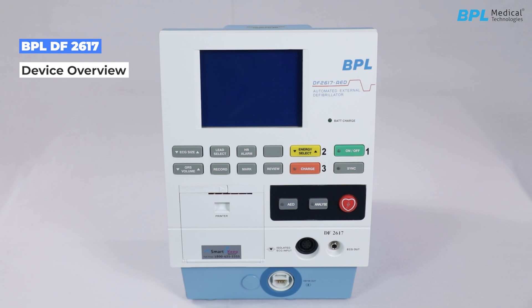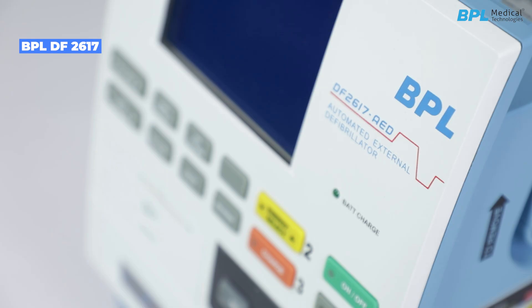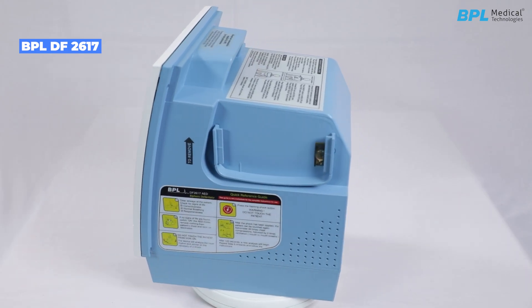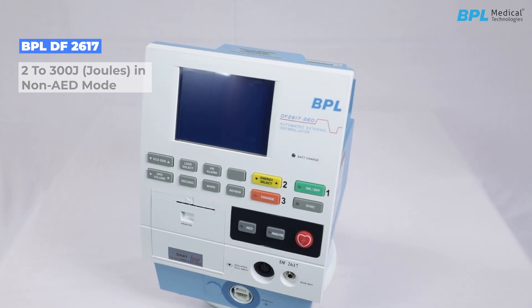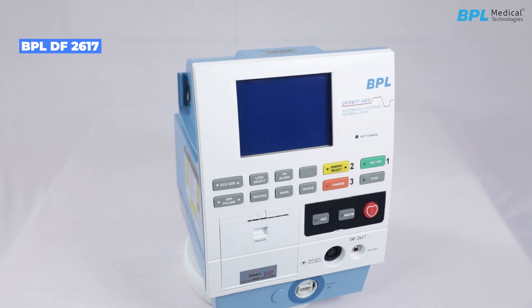Device Overview: The DF-2617 is a lightweight portable device that incorporates an ECG monitor and a biphasic defibrillator with an optional AED. It is equipped with external paddles suitable for adult and pediatric use. The user can select energy values from 2 to 300 joules in non-AED mode. The device also offers an optional feature of a built-in thermal recorder.